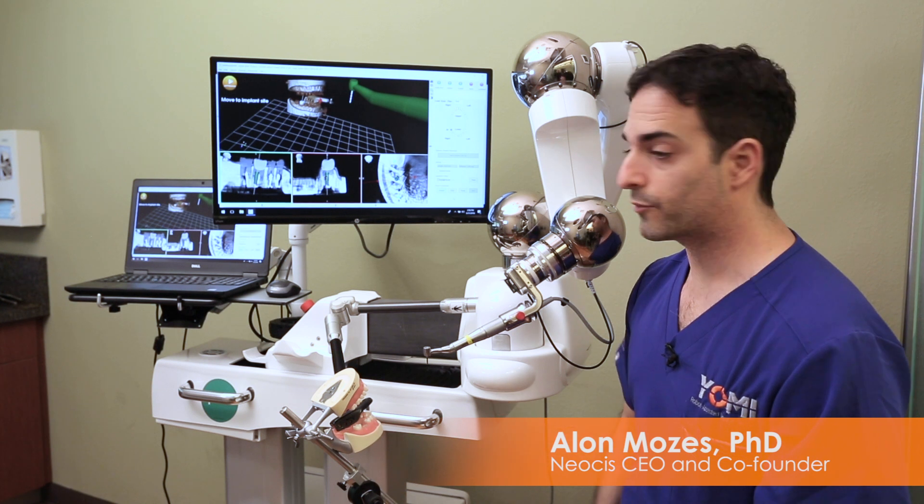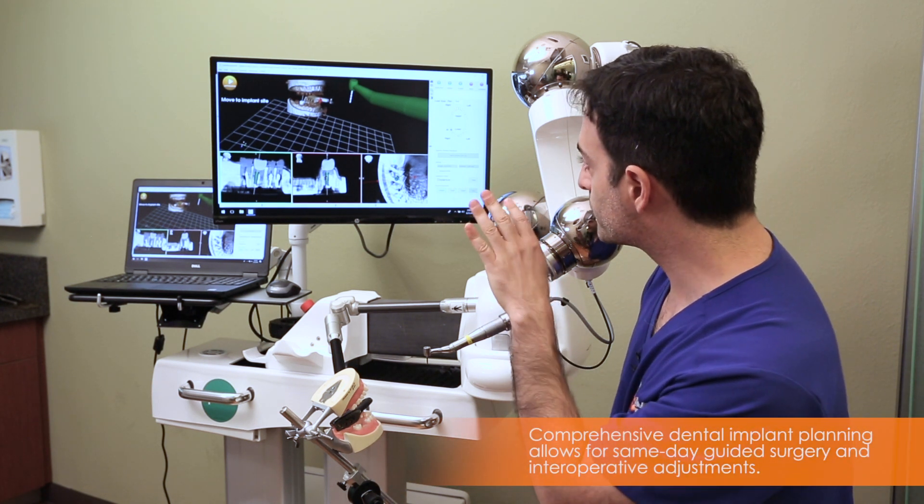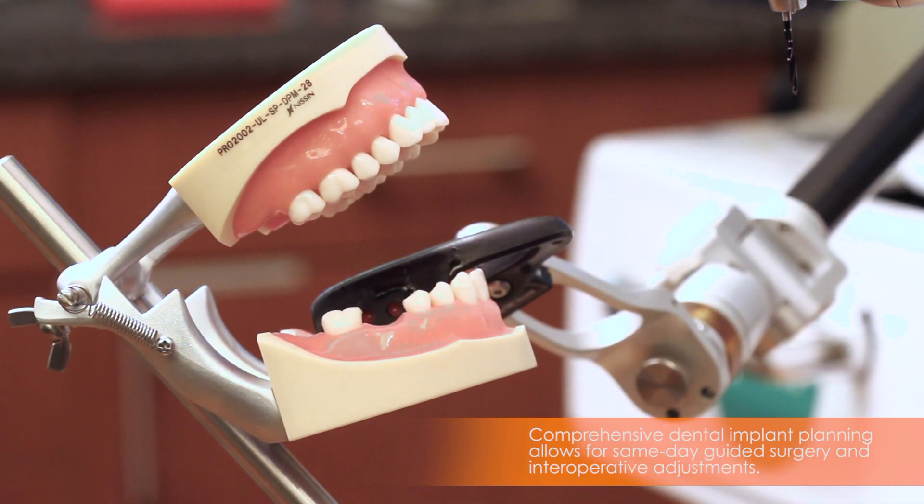Here we have Yomi prepared for surgery at this point. We have planned the case — an implant in the lower right, number 30. The extraction has already been done.